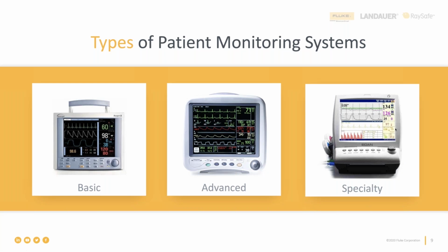So those are the three main buckets. And I know that I threw quite a few terms and acronyms at you right now, but rest assured, we'll go into more detail as we progress through this webinar. But what you should take from this is that the type of patient and the patient's condition will dictate what type of monitor is needed, as well as what you might expect to see as you walk into the ICU versus the emergency department.